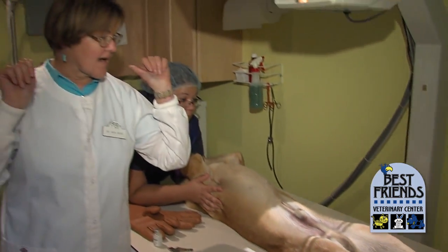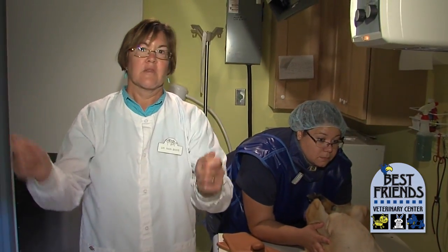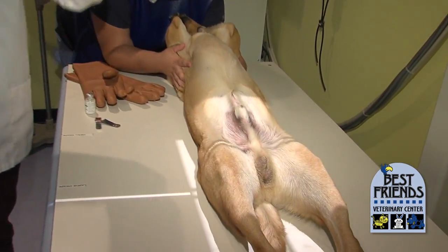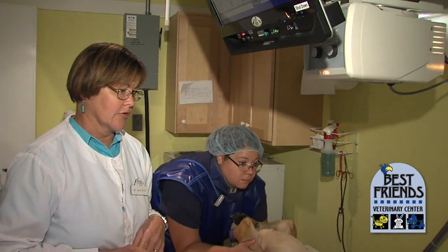When Murray is laying on his back, the x-ray beam comes from the top. The picture that we get when you look at it on the screen is going to be exactly like we're looking at him now. When I show you the x-rays on the view screen, right is on the left and left is on the right — you're just pretending that you're looking at him from the top down.